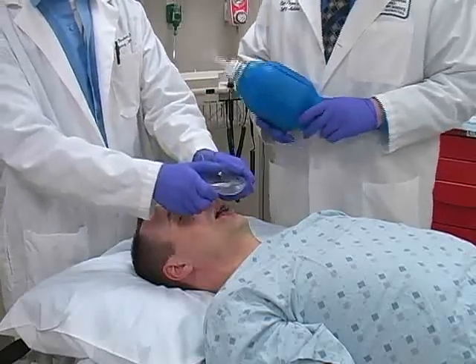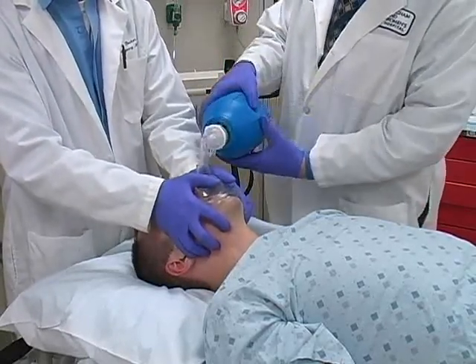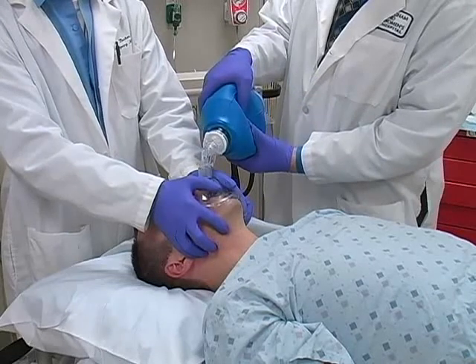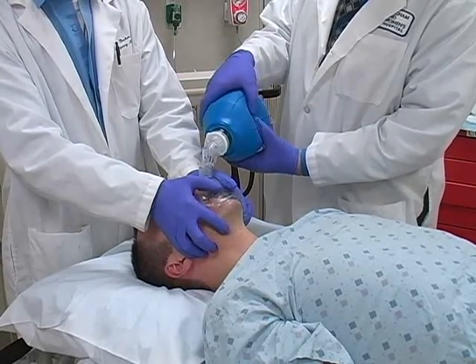This technique is easier to perform, allows stronger hand muscles to maintain a proper seal, minimizes fatigue, and enables 4 fingers to perform chin lift and jaw thrust.